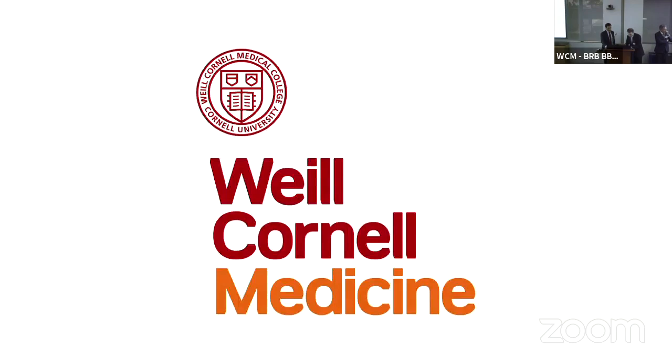But I think what you have to do is use it every day, use it in the simple cases, for the open, simple 4 or 6 lumbar screws. That way you get used to navigation, and all the team gets the workflow, when to put the CT, when to take it out. So now we are using both systems. We are using the Aero, and we are using the Medtronic arm, and I'm very happy with navigation. And now the time it takes is even shorter with navigation than without navigation.